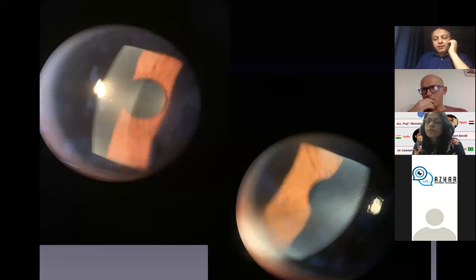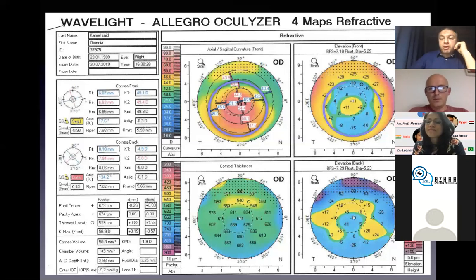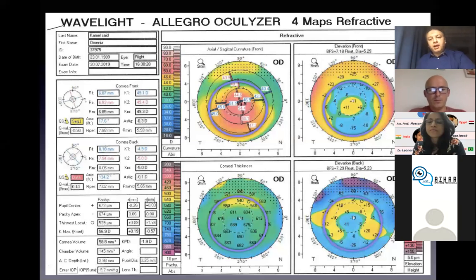You know that when I sent her here for the Pentacam, the interpreter gave me the conclusion as a post-LASIK ectasia. She was shocking me more. But when I checked the thickness, I shifted my mind to another thing. So I think it's a somewhat tricky case because it is after LASIK. The first thing to think about is post-LASIK ectasia, but actually she's not.